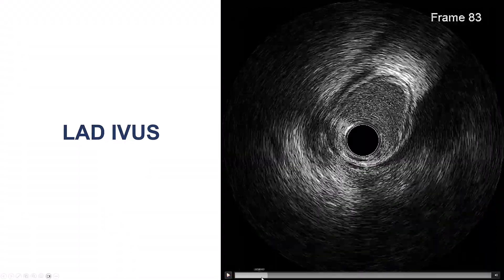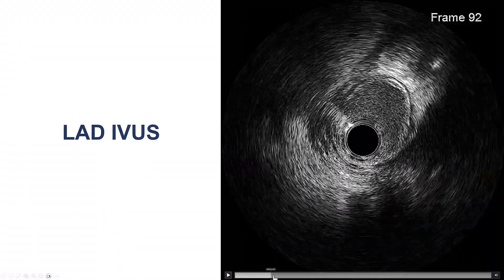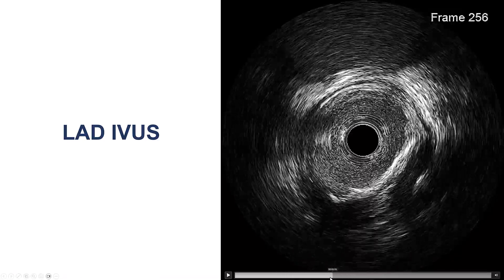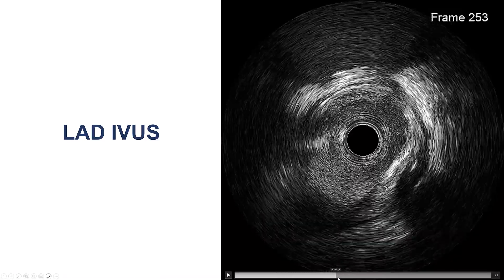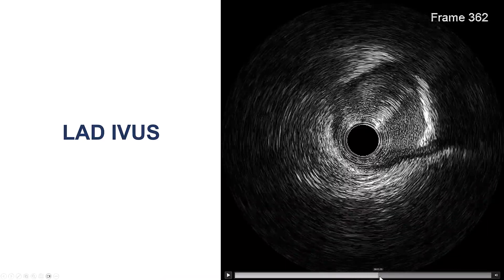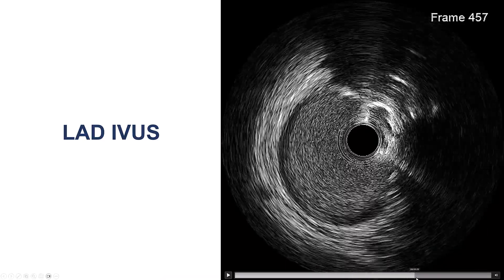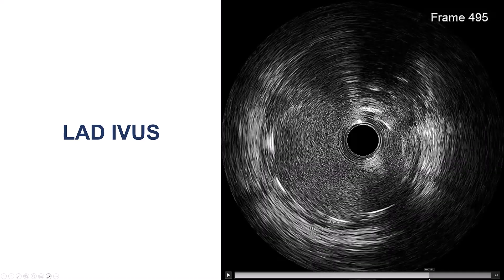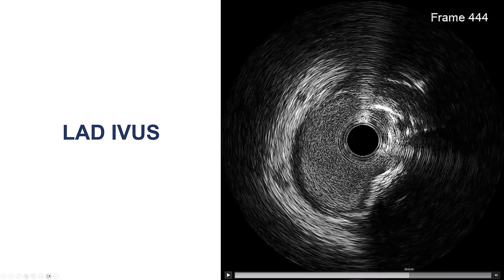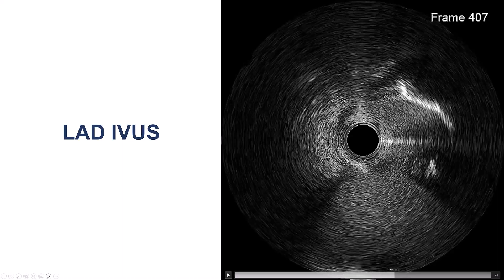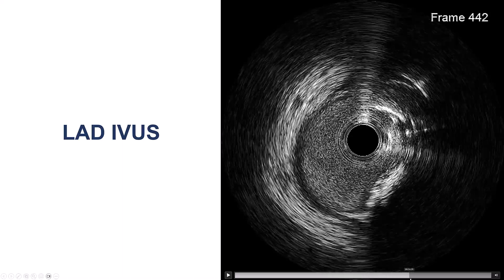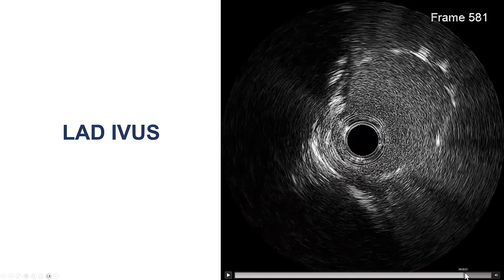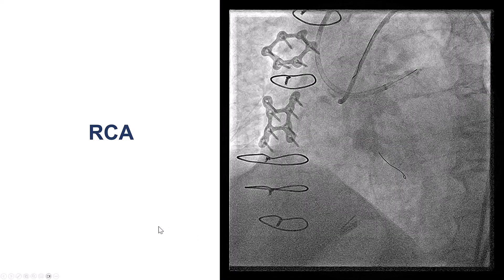Because of the left main, we decided to make sure that there is no significant disease. As we came back, there was some distal left main disease, but the minimum lumen area was 7 mm squared. This is the stent in the left main. When we go back towards the LAD, there is some distal left main disease as the circumflex comes out, but overall the left main was okay. So we did not have to do anything else with the left main.